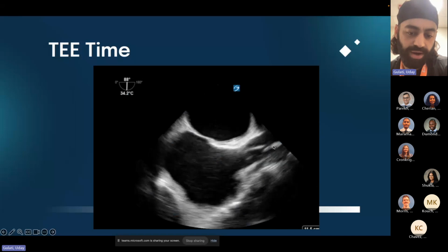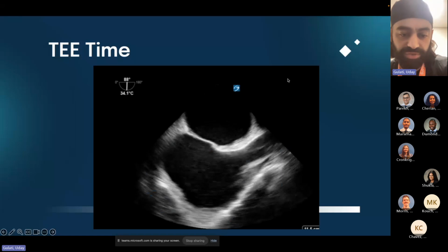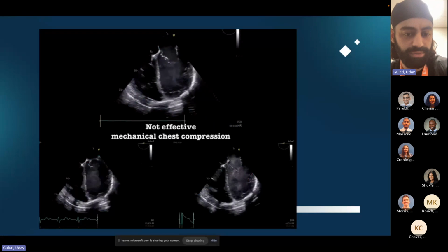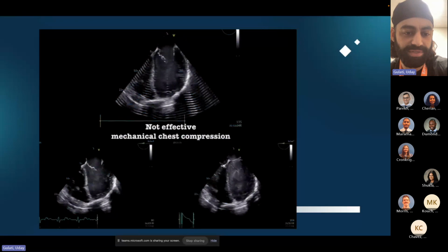Imagine trying to do this procedure and then you enter the wire, it goes like this, and then curls up in your RA, and then you decide to advance this catheter. That could be pretty dangerous. I'll send you guys a lecture in next week's email that I thought was pretty cool. They have some really crazy cases with some crazy ECMO cannulations.